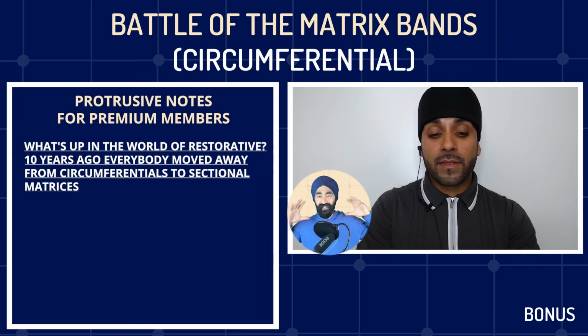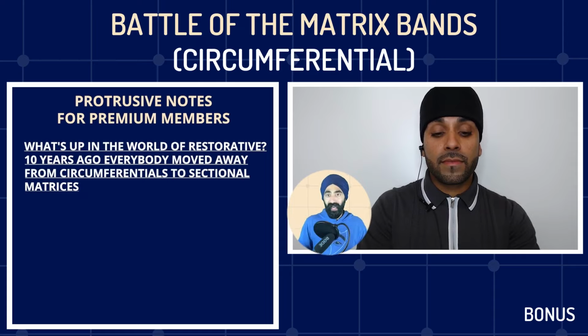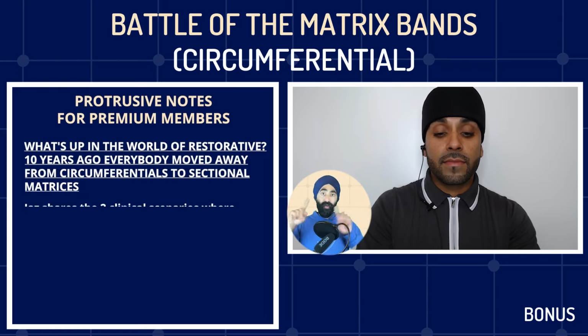So tell me, Sunny, what's up in the world of restoratives? There was an uprise around about 10 years ago where everyone was moving away from circumferentials, and it was like, if you're not using a sectional, then you are a bad dentist, or you are not doing a good job, or you are taking too many shortcuts. So everyone kind of moved to sectionals, and I've got a drawer full of different varieties of sectionals. But for me, where I find circumferentials still very much useful is in two scenarios and two extremes.